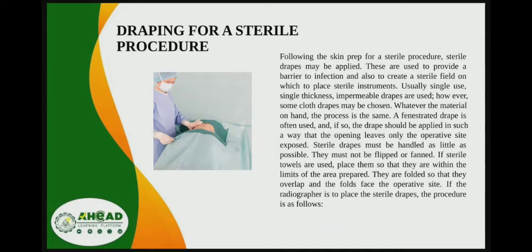A fenestrated drape is often used, and if so, the drape should be applied in such a way that the opening leaves only the operative site exposed. Sterile drapes must be handled as little as possible.